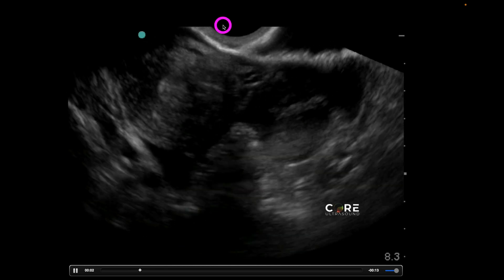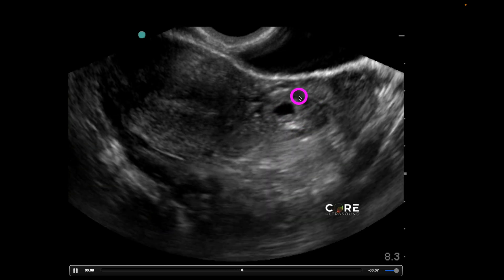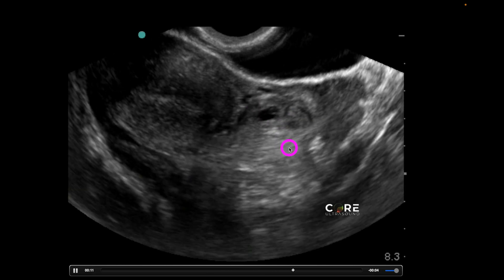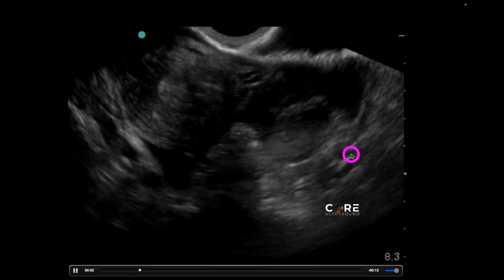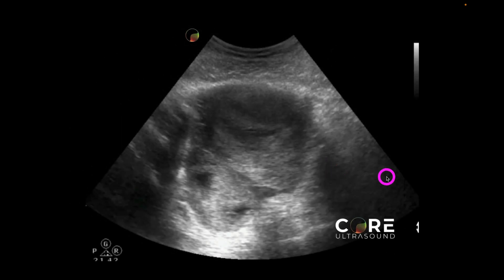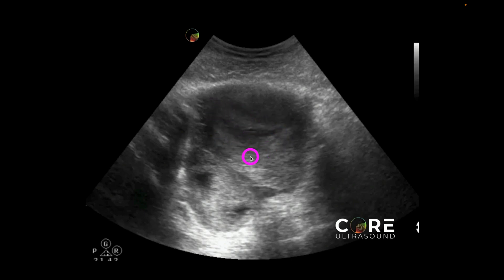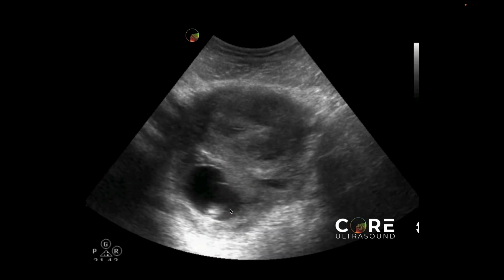Here is another example using an endocavitary transducer. We have the uterus here, and then off of the uterus in likely one of the adnexa, rolling around, is that gestational sac. This right here is likely intestinal movement, and we can see a blood vessel over here, likely the iliac artery. Here using a curvilinear transducer we are seeing the uterus and fundus in short axis, with a bit of hypoechoic fluid and a decidual reaction, but the gestational sac is seen down here outside the uterus — another example of an ectopic pregnancy.